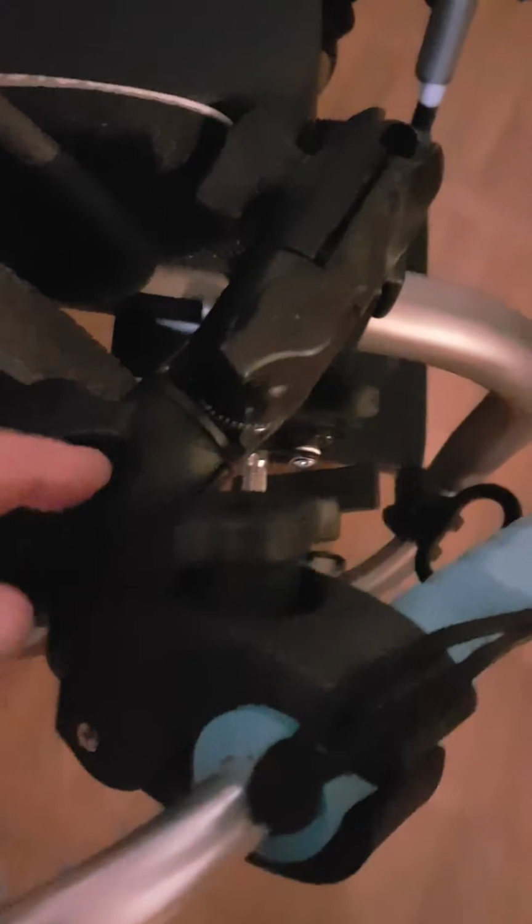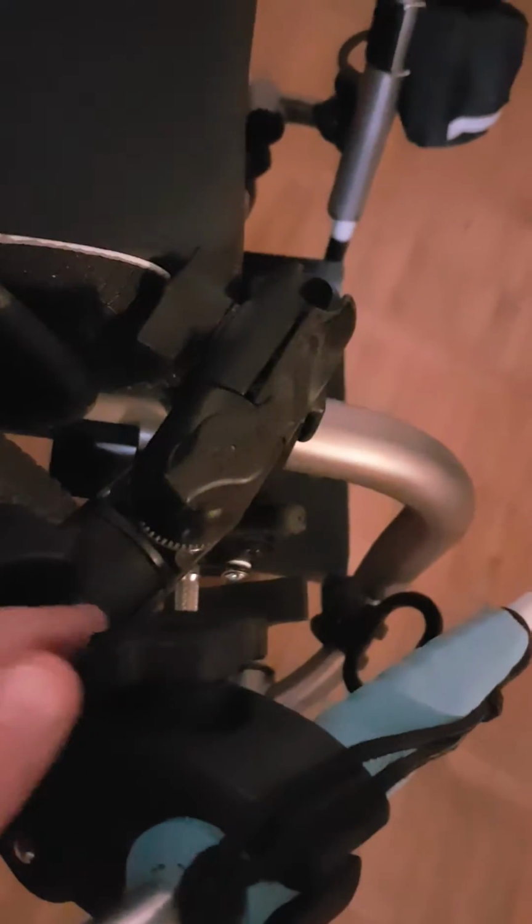Okay, hang on. So, where is it? There it is. Sorry, guys. Okay, so this one here is the first arm. I don't know how well you can see it, but there it is. That's the one hooked onto the clamp that's clamped onto my cane. And the little kind of lever-shaped cap here, that's the screw that tightens the socket.